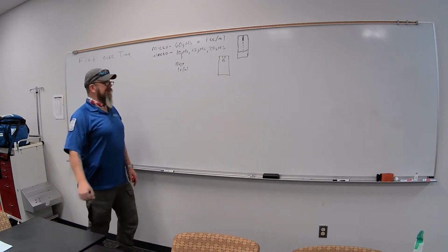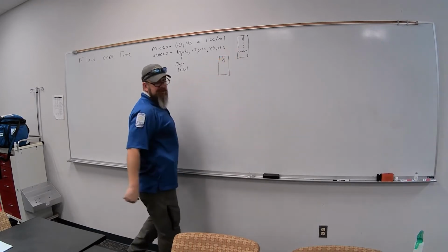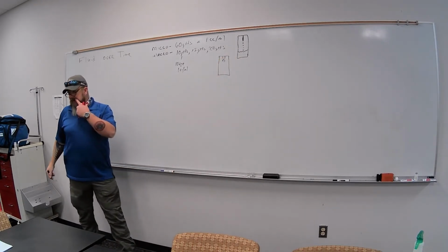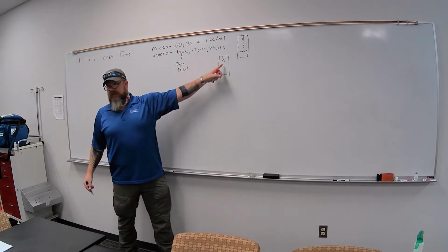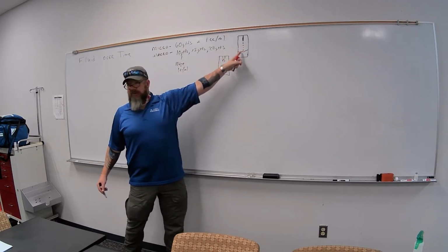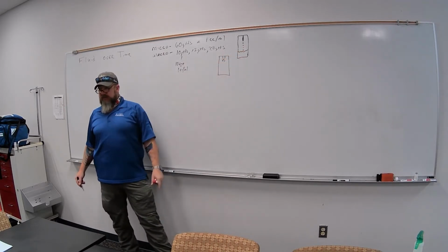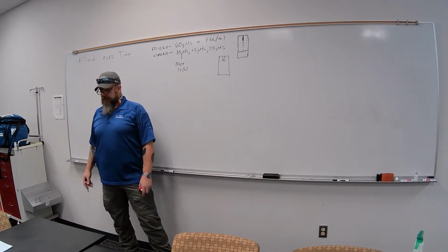In fact, they'll be 6 times bigger in a 10 drop set than in a 60 drop set, because it takes 10 drops to make 1 ml versus 60 drops to make 1 ml. Does that make sense? That's how we get the drop set size.